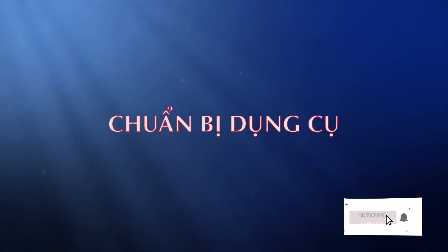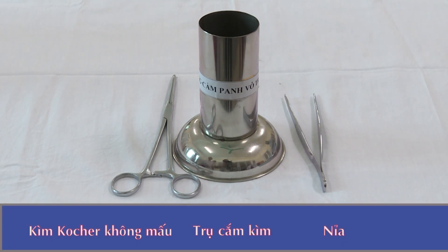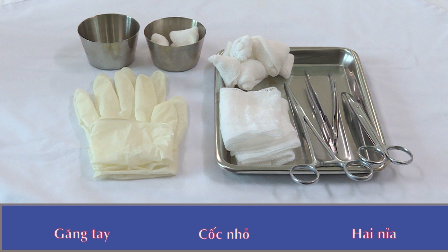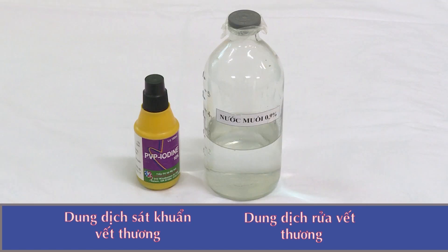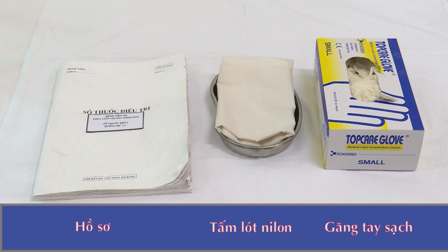Để tiến hành kỹ thuật, trước tiên chúng ta cần chuẩn bị dụng cụ và phương tiện kỹ thuật trên xe tiêm 3 tầng như sau: một khay sạch gồm băng dính hay băng cuộn, một kéo cắt băng dính, một bộ huyết áp, một tai nghe, một khay quả đậu, găng tay sạch, một tấm lót ni lông, và hồ sơ người bệnh.